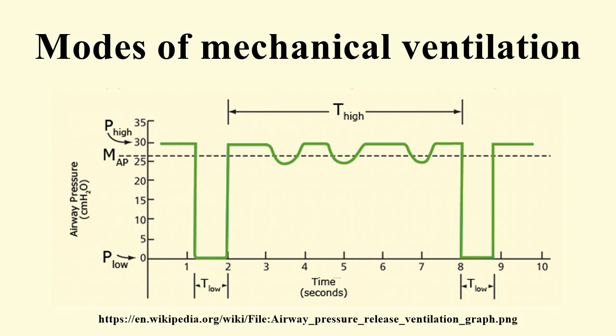Pressure support is a spontaneous mode of ventilation, also named pressure support ventilation. The patient initiates every breath and the ventilator delivers support with the preset pressure value. With support from the ventilator, the patient also regulates their own respiratory rate and the tidal volume. In pressure support, the set inspiratory pressure support level is kept constant and there is a decelerating flow. The patient triggers all breaths. If there is a change in the mechanical properties of the lung, thorax and patient effort, the delivered tidal volume will be affected.